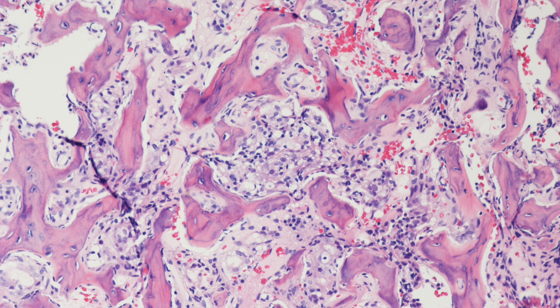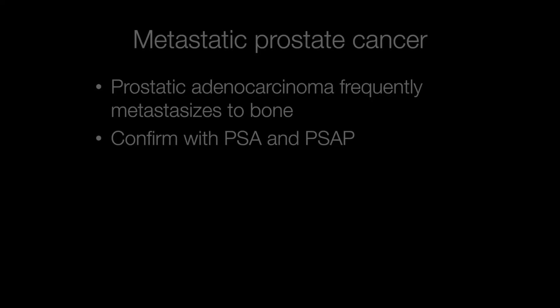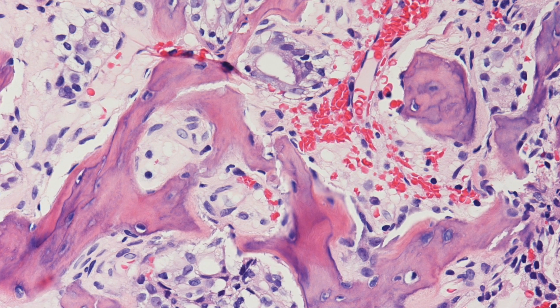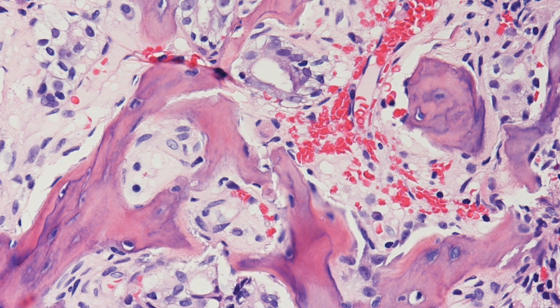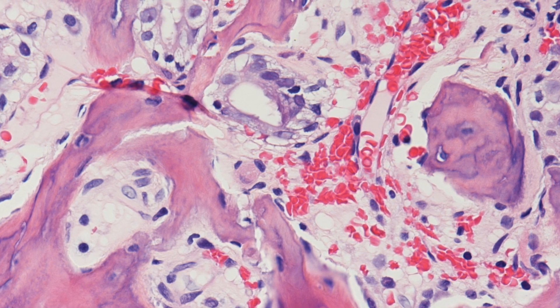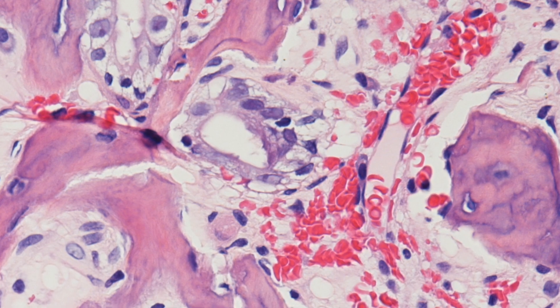The fifth case was the vertebral biopsy from a 76-year-old man. This contains metastatic adenocarcinoma — in this case prostatic adenocarcinoma. Prostatic adenocarcinoma frequently metastasises to bone, and the confirmatory markers are PSA and PSAP. Here you can see a rather sclerotic metastasis of adenocarcinoma, zooming into a well-formed gland typical of prostatic adenocarcinoma, which will show positive staining with PSA or PSAP.